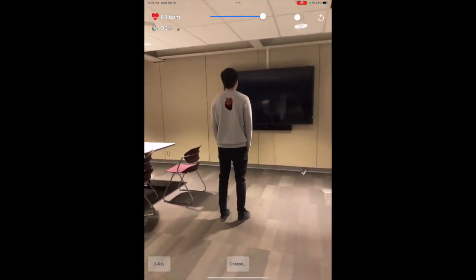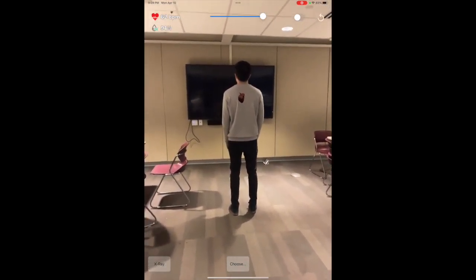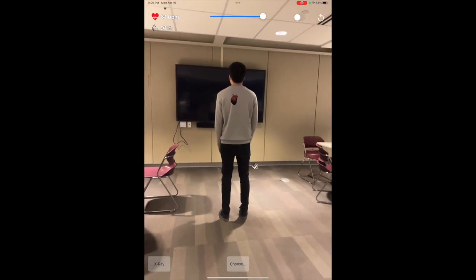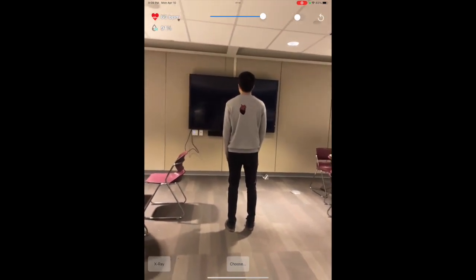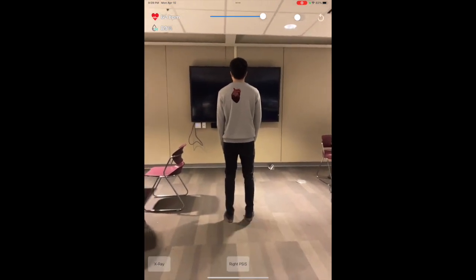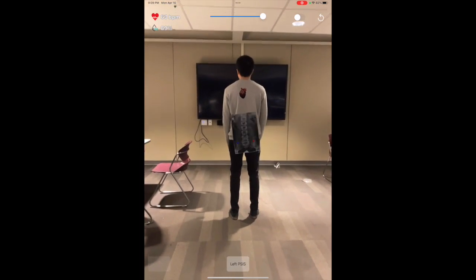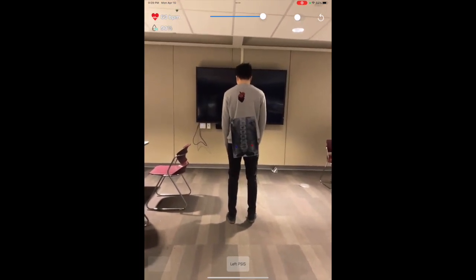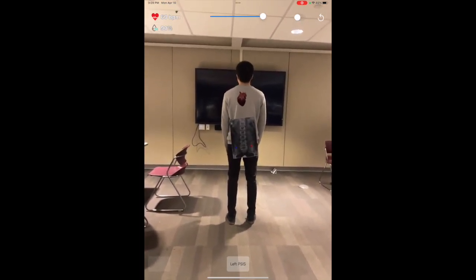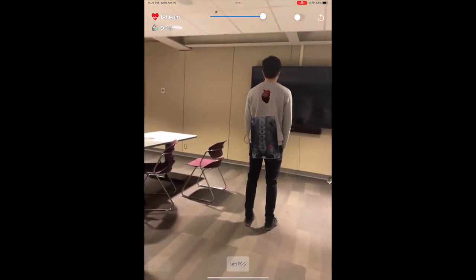Our app can also display AR medical images over a person's back, such as an X-ray. You can place points manually on a person, which can show an image on a person's back. As you can see, this image is also placed in 3D space. You can get a full surrounding view of how it stays on the person.